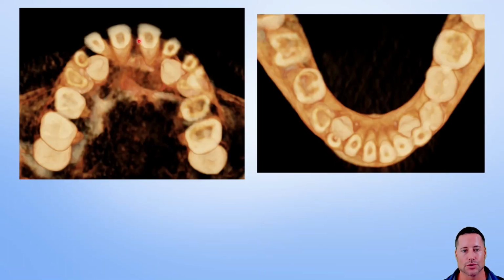If we look at her occlusals, here's the upper here, here's the lower. So not only are those upper 3s significantly palatal, but look at the lower. We never would have known that, right?